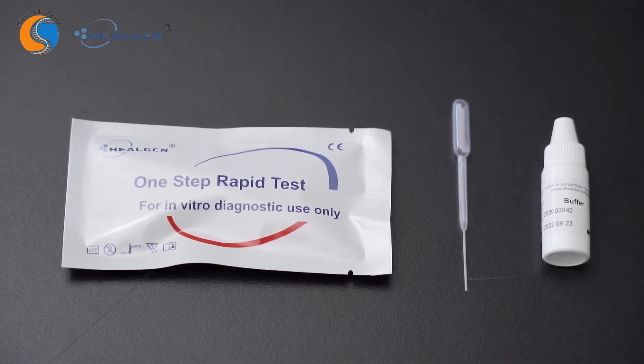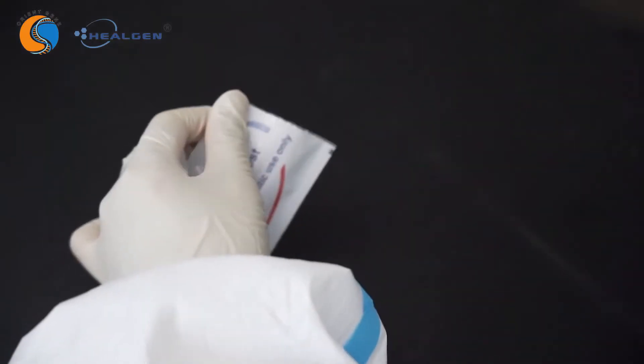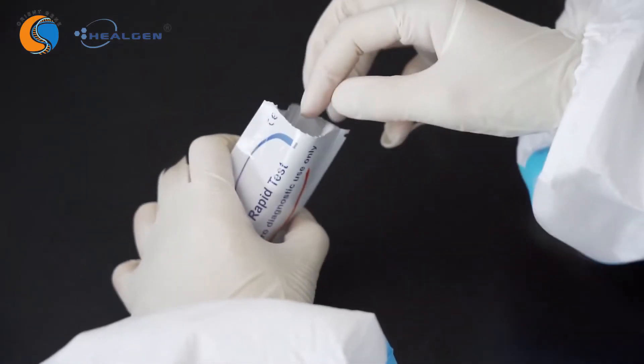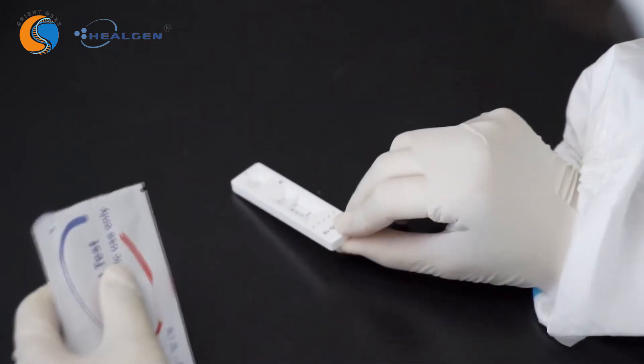Allow the test materials and specimen to reach room temperature before testing. Remove the test cassette from the sealed foil pouch. Do not open the pouch unless you are ready to begin the test. Place the test cassette on a dry, flat surface.